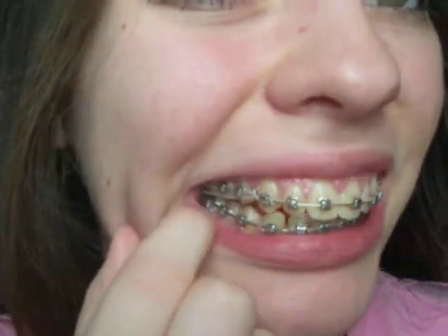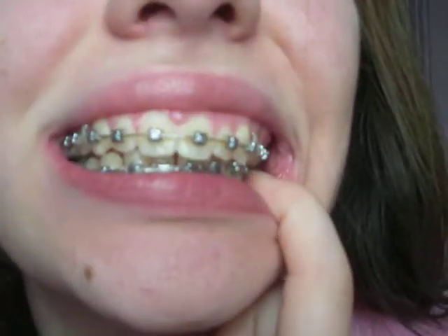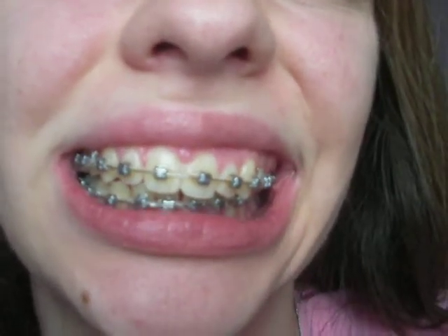The other issue is with my bite at the back. You can see the back right molars are touching now, so I can eat properly, which I couldn't do originally. But the back left ones aren't, because the top ones are still overhanging. You can see I've got this kind of overbite on the left side. Kind of lopsided. So again, the orthodontist is doing what she can to pick up those bottom lower left teeth so that the top ones can sit on top of them.